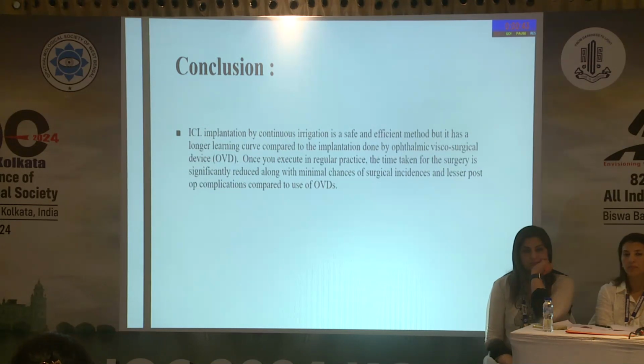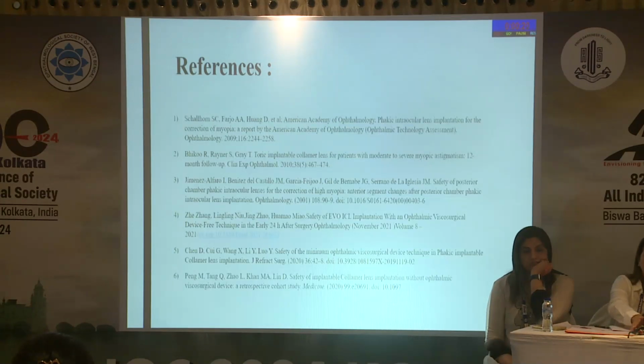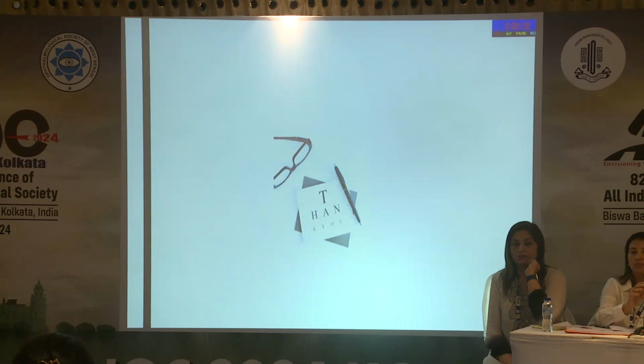So to conclude the study, I will say that ICL implantation by continuous irrigation is safe and effective, but it has a little longer learning curve compared to the implantation done by OVD. But once we execute this practice regularly, the time taken for the surgery is significantly reduced, along with minimal chances of post-op IOP spikes and lesser inflammation compared to OVD groups. These are my references. Thank you.